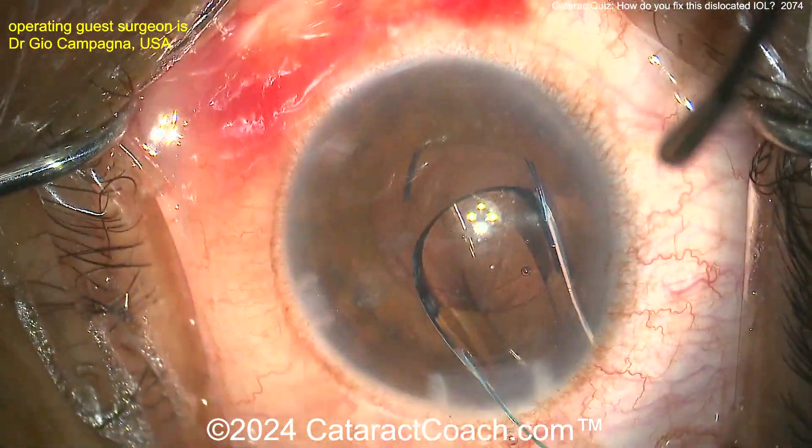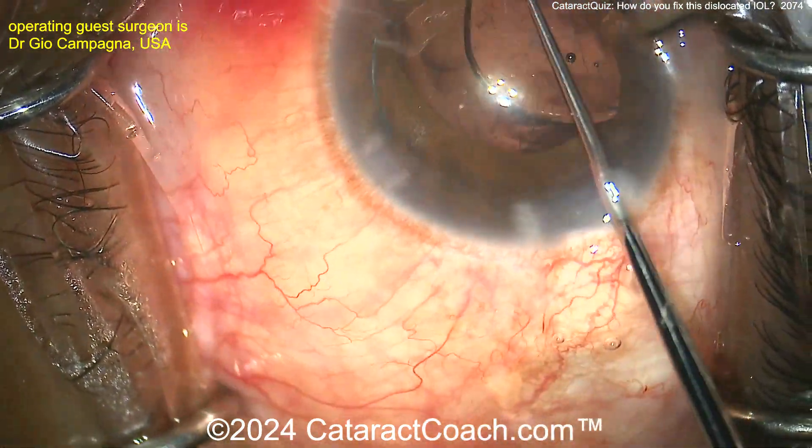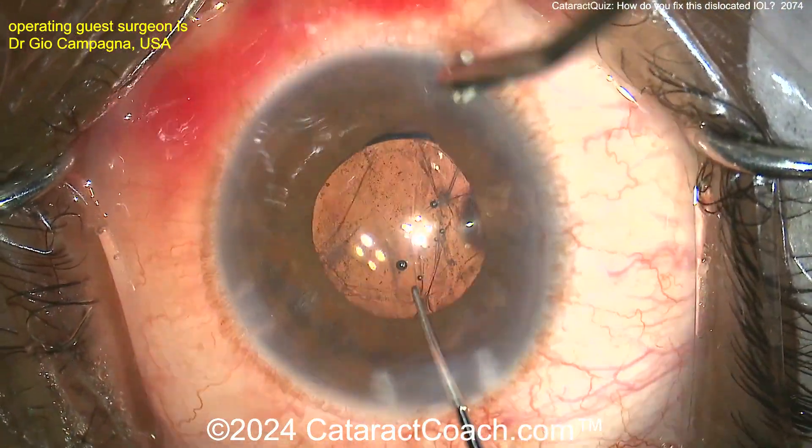Three-piece lens going right in. There is the leading haptic going out — there's the 7L rule, looks good in the correct orientation. Dial that in. Is there just enough sulcus support, or do you need to actually do something additional?